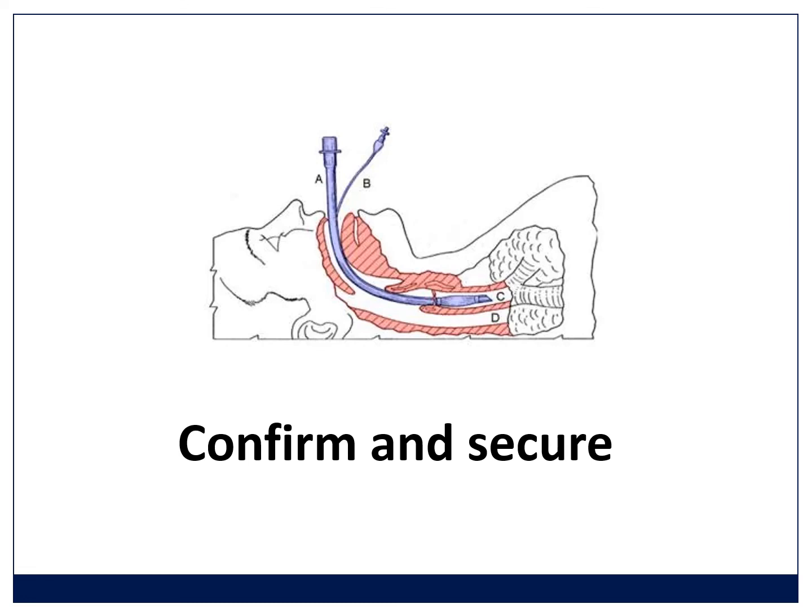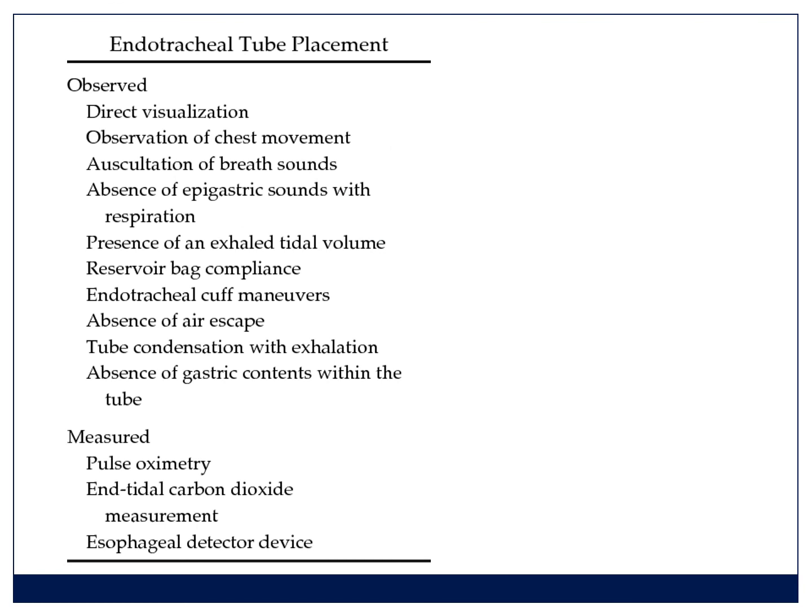So once you successfully intubate the patient, you secure the tube and confirm its position. There are a number of ways you can do this. If I can just mention the ones that I think are important: put the tube in, and when you manually ventilate the patient, the chest must move. The tube should mist. You see that water vapor in the tube. There should be capnography. There should be sounds on both sides of the lungs, so you should listen. And there should be no sounds in the stomach. And finally, the patient should stay oxygenated.